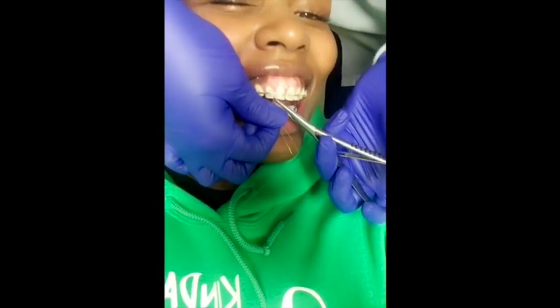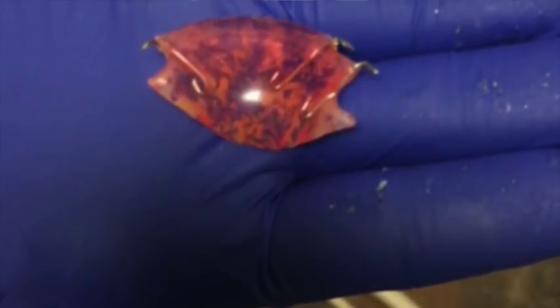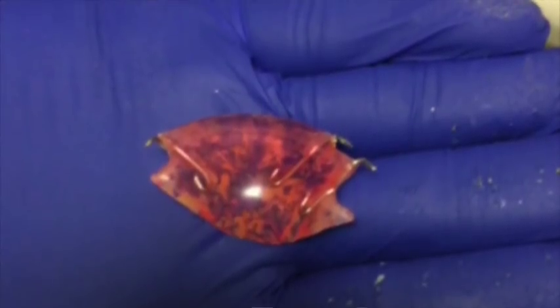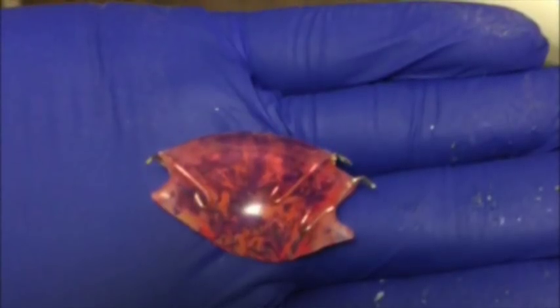I thought that was painful — okay, here comes the bite plate getting taken out. I don't have footage of that because I would have dropped my phone; it was so painful getting that out. Everything swelled up around the bite plate. I had tears in my eyes, my toes were curled in my shoes, I was gripping my keys. And that bite plate — oh my gosh — it smelled so bad because food gets trapped up there and there's no way to get it out since it was cemented in the roof of my mouth.